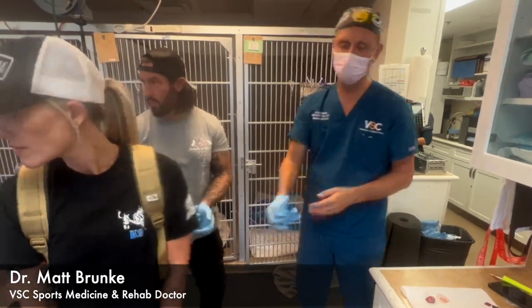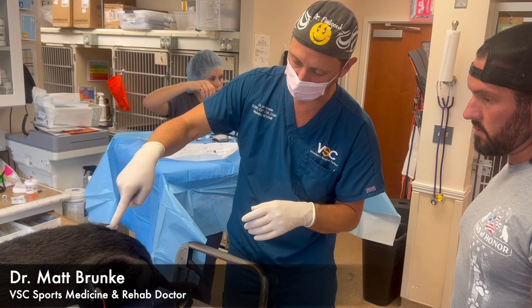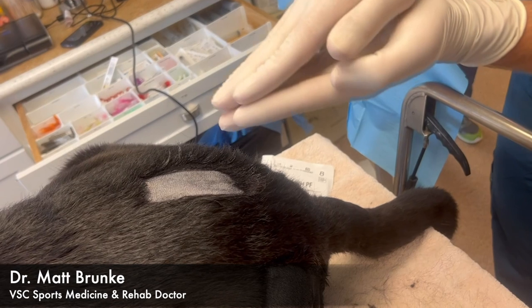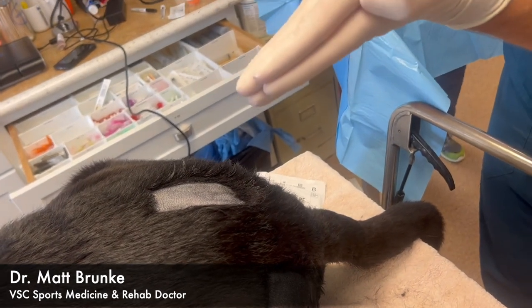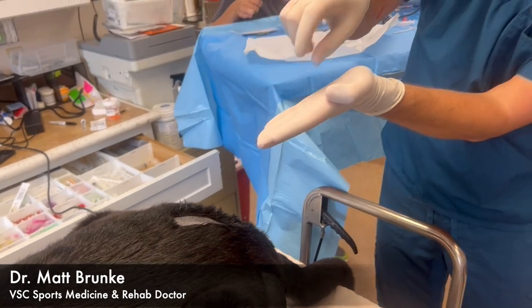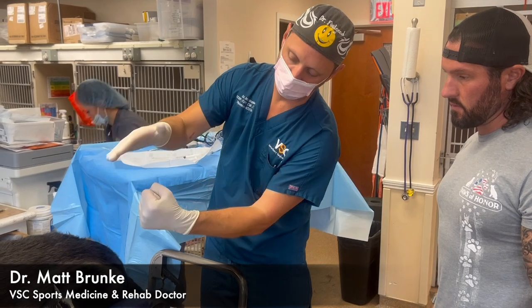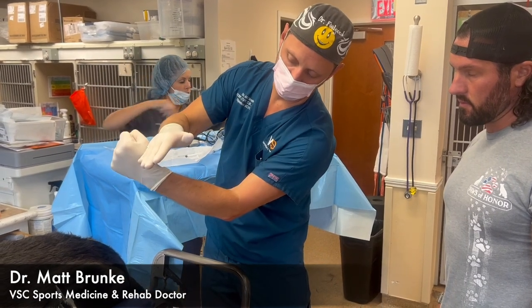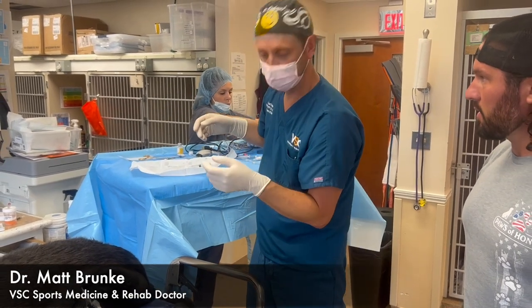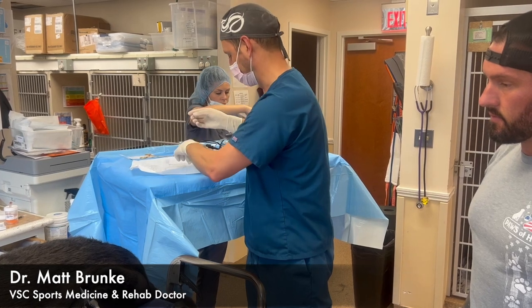That's the access point to his epidural space. I'm going to put a needle into that and push a little bit of saline in to expand it, because it's kind of stuck together. Then I'm going to push some cortisone directly into that space — it's going to get absorbed right on top of that area where the bulging disc is pushing up on his spinal cord. It's a targeted anti-inflammatory right where it needs it.